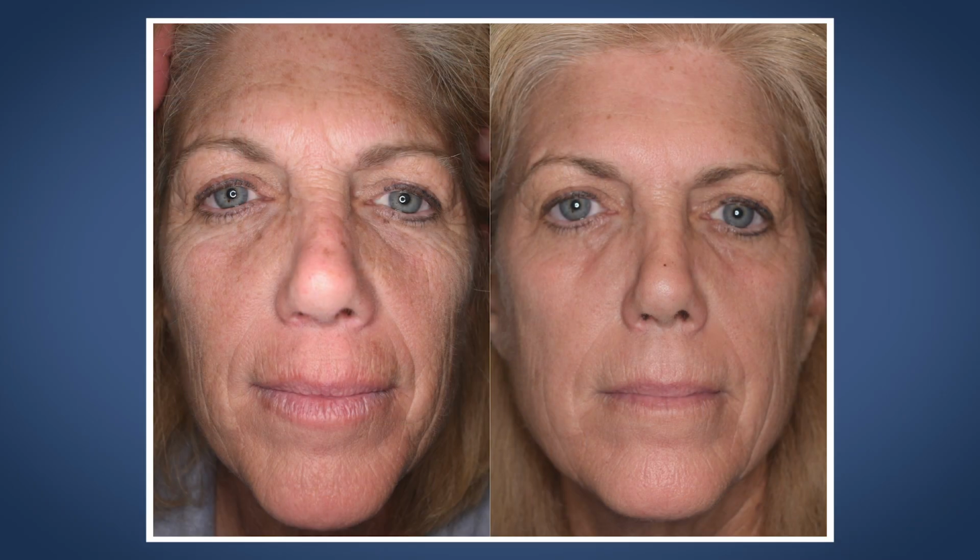But this is fantastic. I mean, that is really quite impressive for just Halo. I have to say, my usual Halo parameters are about 400 microns, about 40% density, and then max out the ablative. And depending, I do it under topical as well. Sometimes I'll talk to the patient if they're really sensitive to pain. We do a small amount of Demerol, but that means they need to have transportation home. But I think it's fantastic. I mean, that looks really quite good.